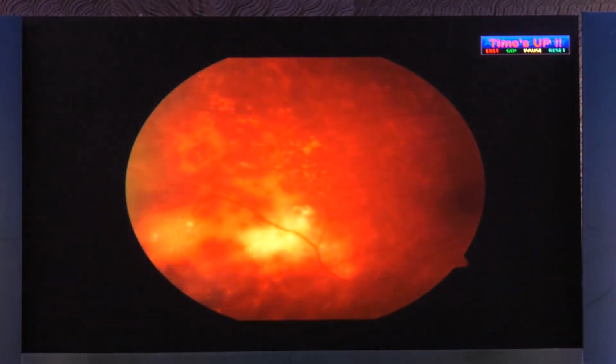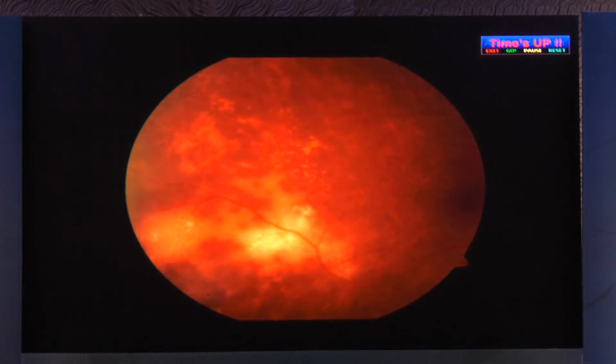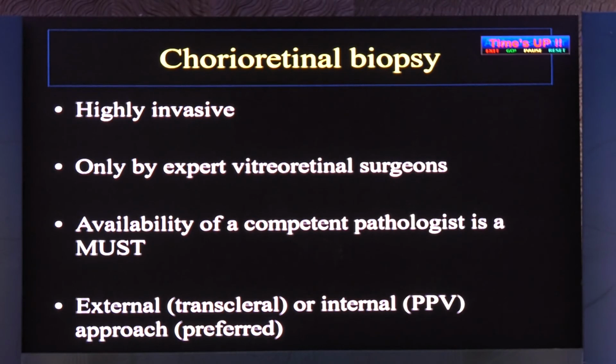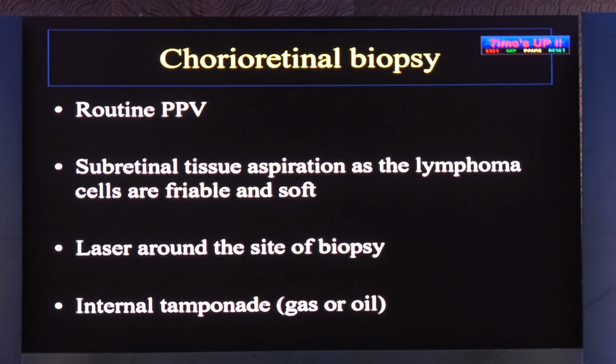Coming to the subretinal biopsy, it's indicated where you see subretinal deposits. So it's a rarer form of diagnostic vitrectomy that we do. Highly invasive, should be done only by an expert vitreoretinal surgeon, and you have to have your pathologist available. It's a must. It can be through an external or an internal approach. The internal one is more common.